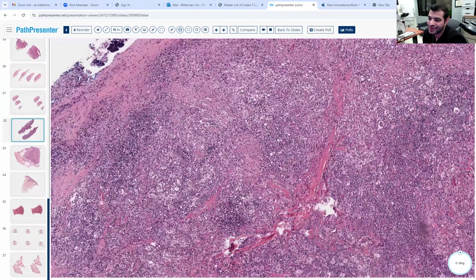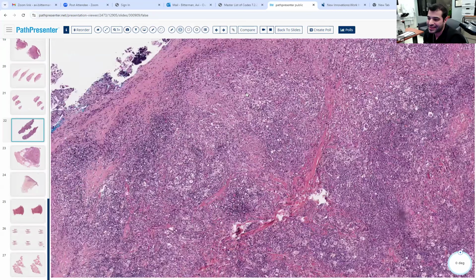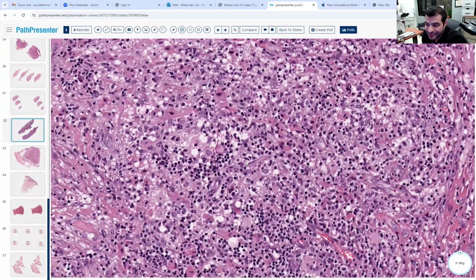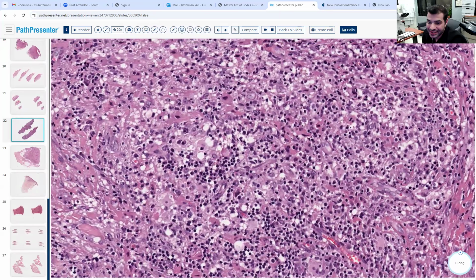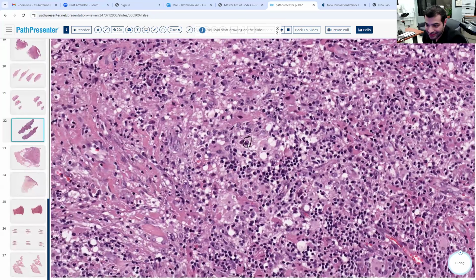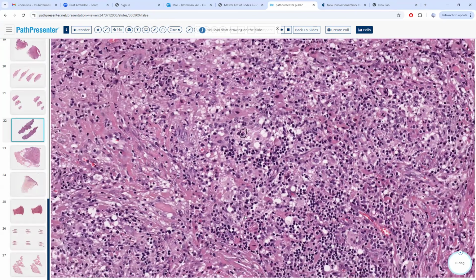So the point is, if you go to the clear areas, you're more likely to see, instead of just a bunch of lymphocytes, the lighter areas, where you'll probably get the histiocytes. And if we look at those histiocytes, there's another cell we can see here. We can start seeing these cells, which are plasma cells.